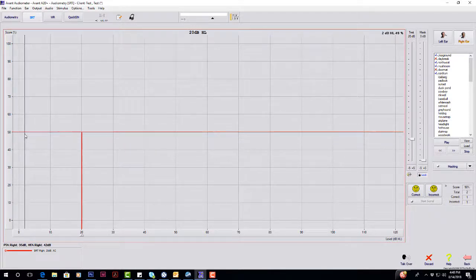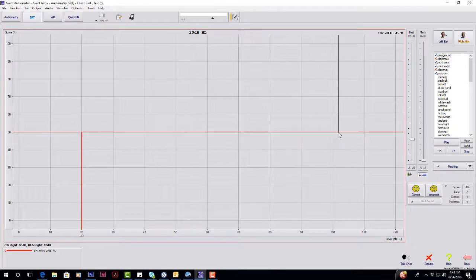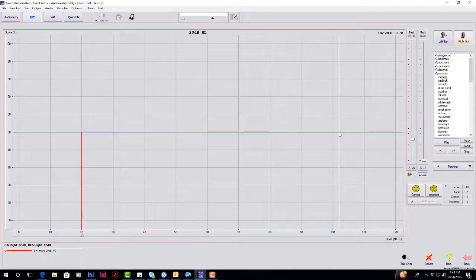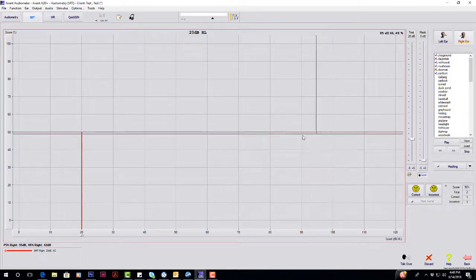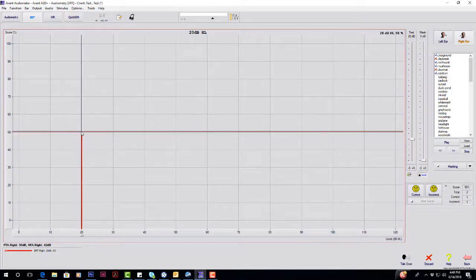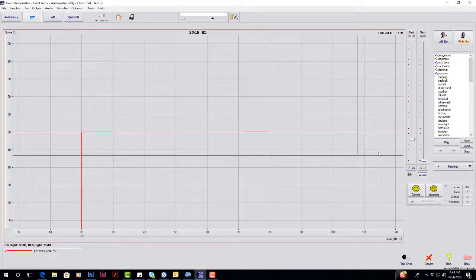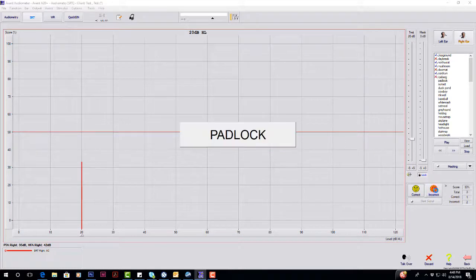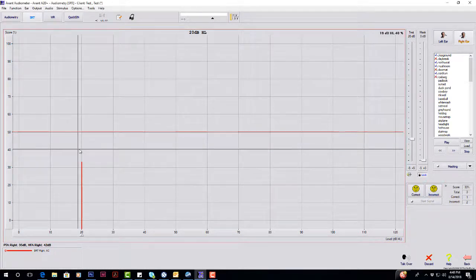If you want your SRT to show up on the printout, you have to be at 50% or above for that particular dB level. So if I were to hit Incorrect and it's below 50%, it's not going to show up on your score on the printout. So it has to be at 50% or above.